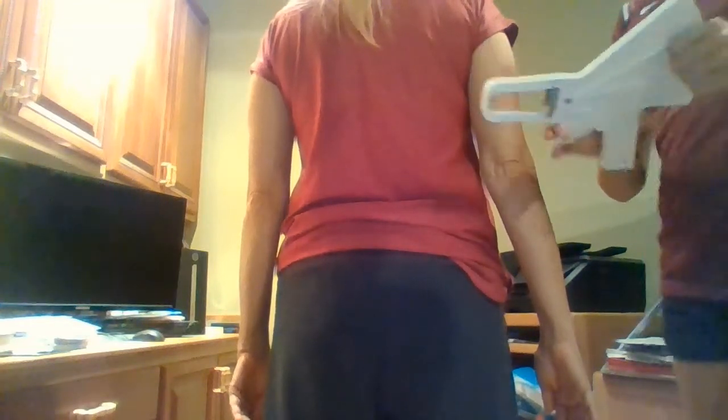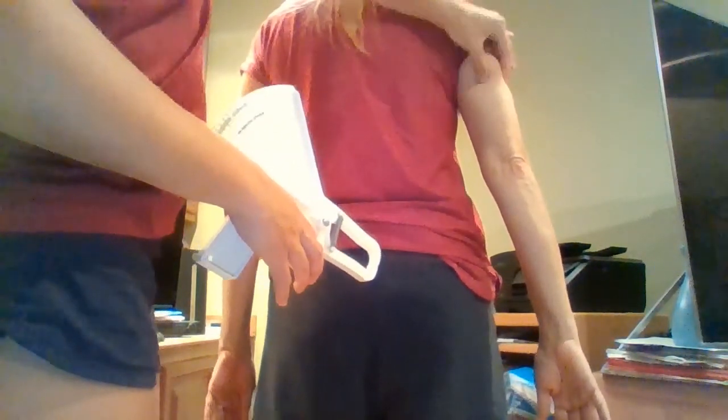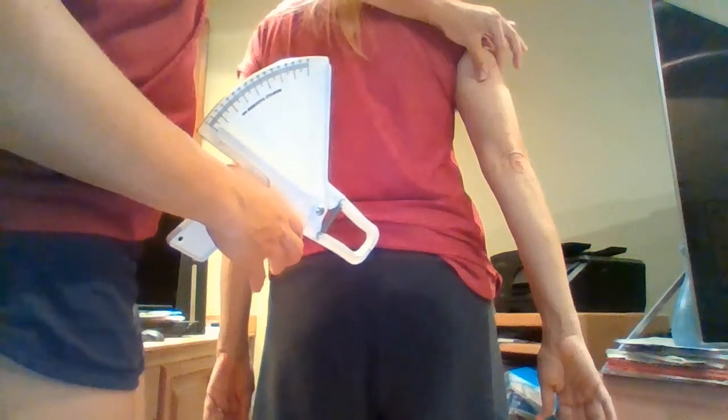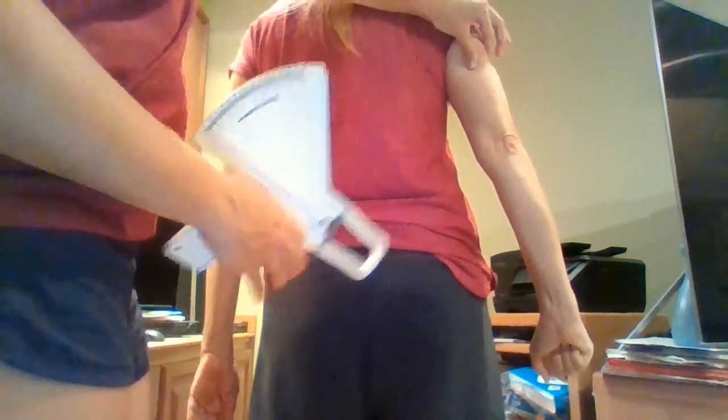All right. So as you can see, the mark is right here. The skin fold caliper measures in millimeters. So what I'm going to be doing is trying to grab her fat. I don't want to just grab the skin right here, and I don't want to grab the entire muscle. So I'm going to grab at a perpendicular angle on the belly. And go ahead and squeeze your tricep for me. All right, perfect. So you can let go now.